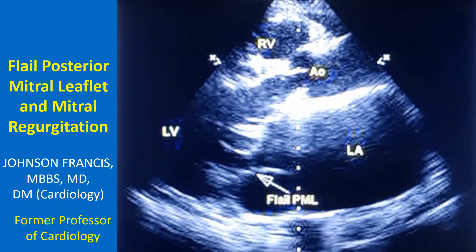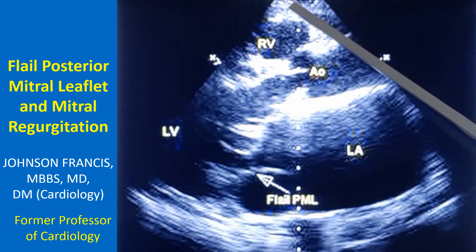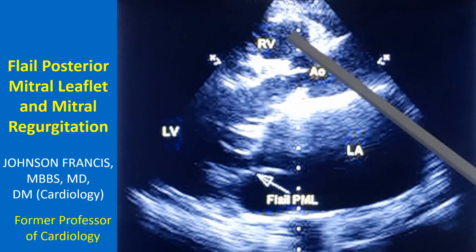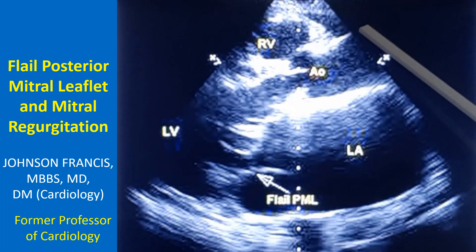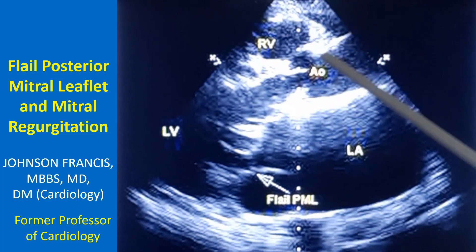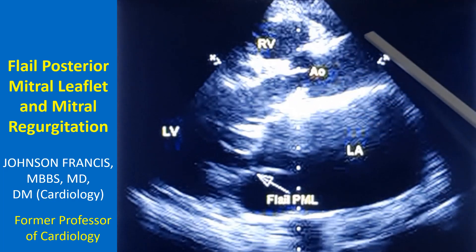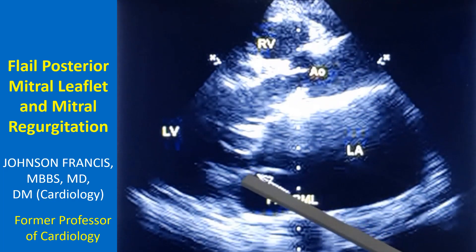This is an echocardiogram in the parasternal long axis view. The transducer is kept on the anterior chest wall and the echo beam is parallel to the long axis of the heart. The long axis of the heart is the base to apex axis.